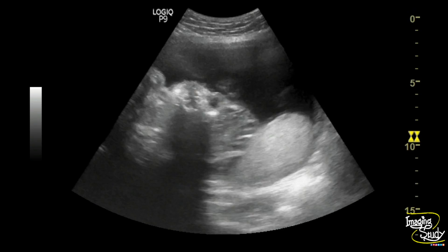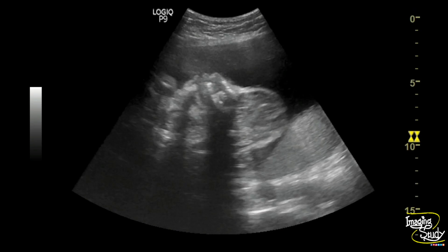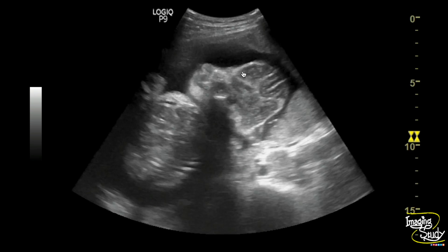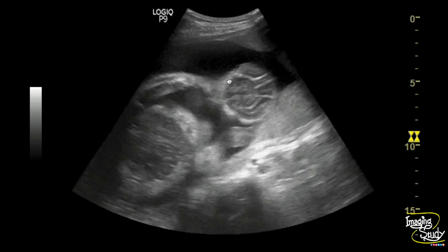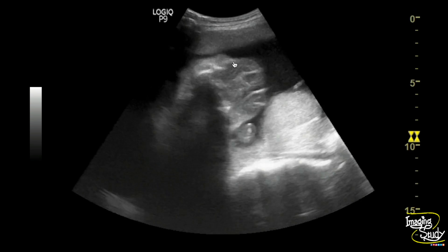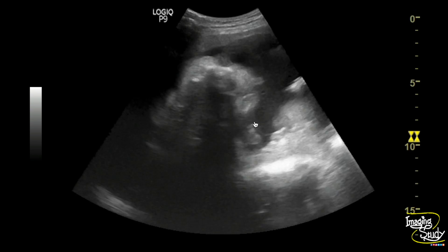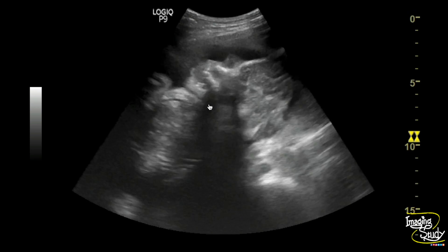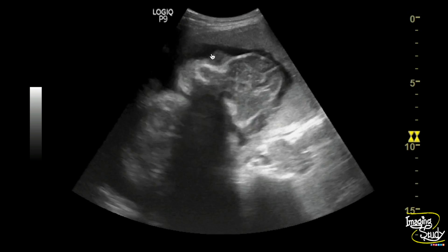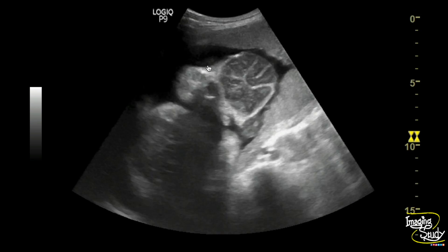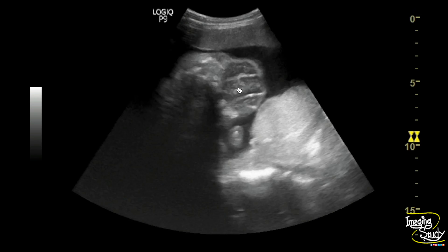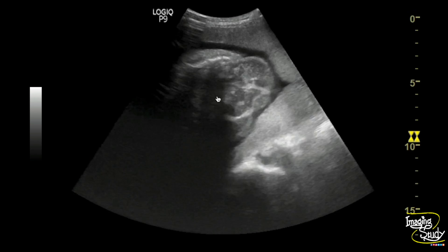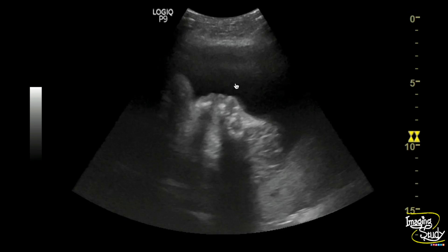Here you can see the profile view — that is the sagittal view of the fetal head — and you can see there is no calvarium above the fetal orbit. The brain surface appears irregular, indicating area cerebrovasculosa, and you can see the eyes are quite proptotic, coming out from the fetal orbit, indicating shallow orbits secondary to cranial bony malformation.